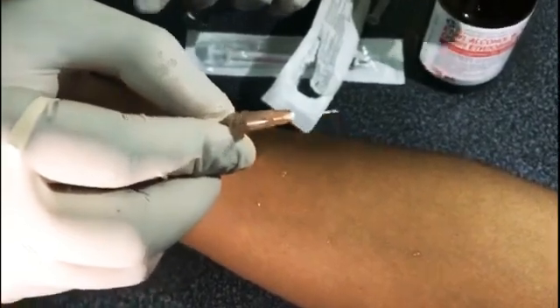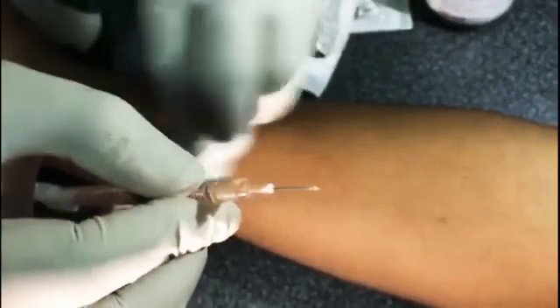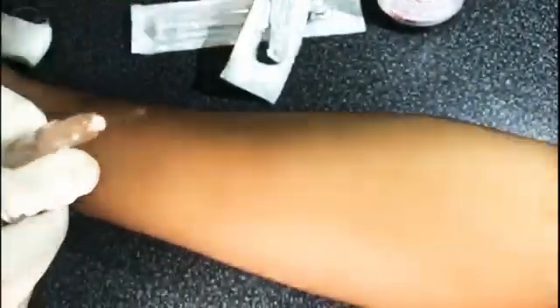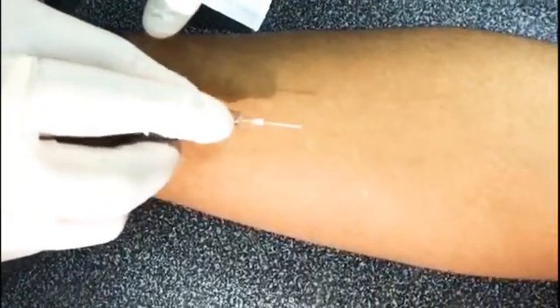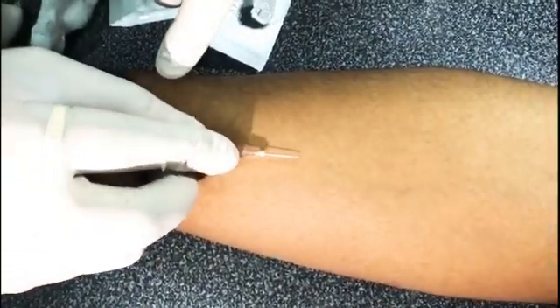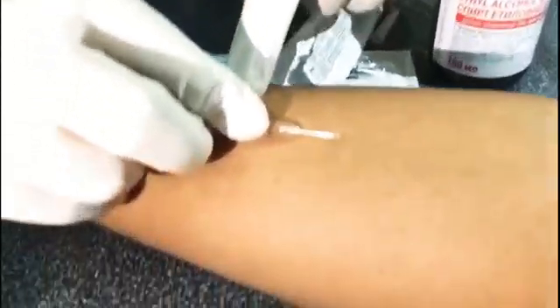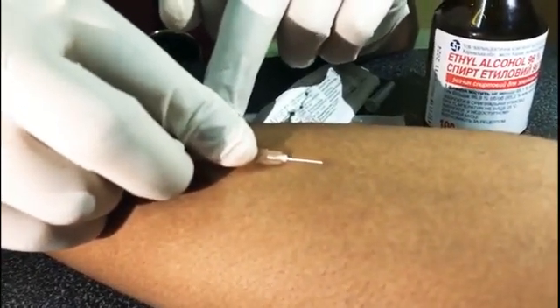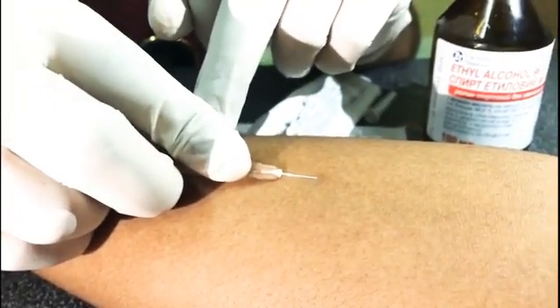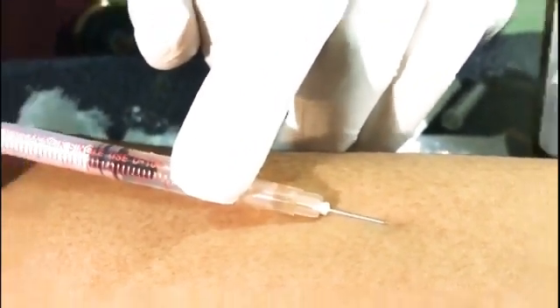Use the sharp tip of the needle at the injection site on the dermis. Make sure that the site is dried. Place the needle at a 10 to 15 degree angle towards the layers of the skin and prick slowly into the dermis. Just the needle tip has to go in between the epidermis and hypodermis — hold the part steady and give the injection.